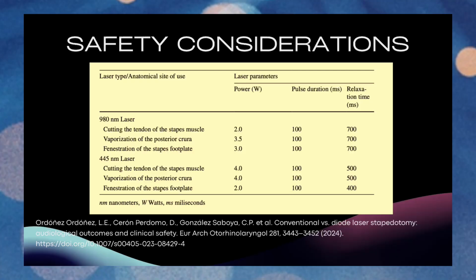When you start using things like 6 watts, 8 watts, 10 watts, those are for soft tissue ablations of larger quantities. But this, 1 or 2 at the footplate, okay? And then you'll be safe.